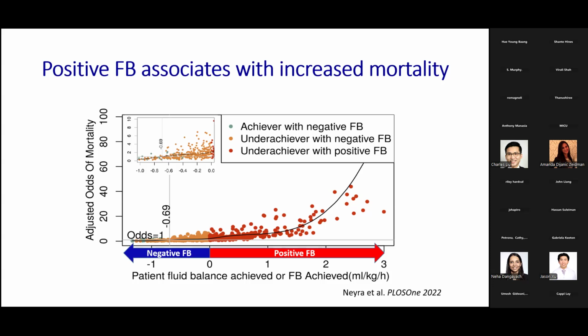Also, we noticed that some patients were achieving negative fluid balance, represented here in the tail in orange, but not necessarily close to the goal that the clinicians were prescribing. Let's say a clinician rounds this morning and says, well, I want this patient in the next 24 hours to achieve a negative fluid balance close to a liter. And then you come in the subsequent evaluation, you see the patient was not achieving that negative fluid balance, was only negative 300 milliliters, let's say.